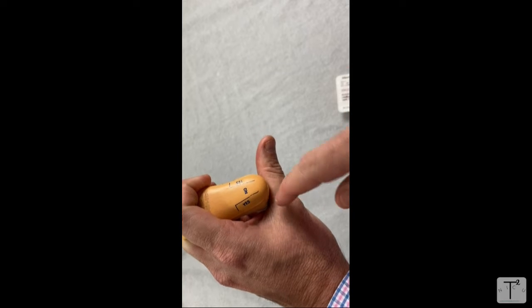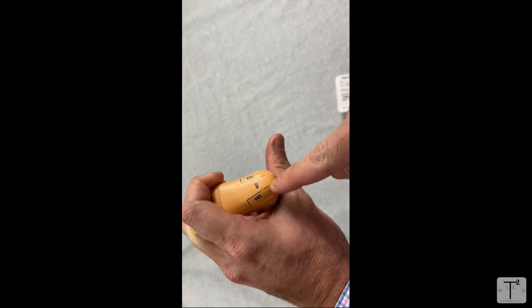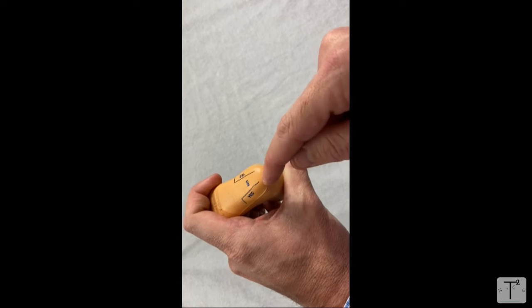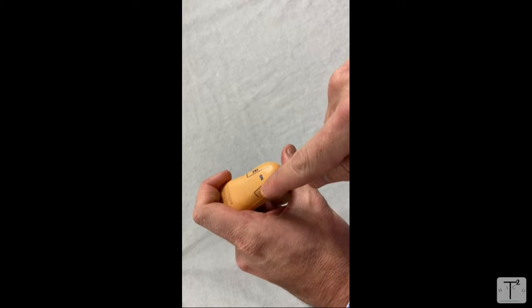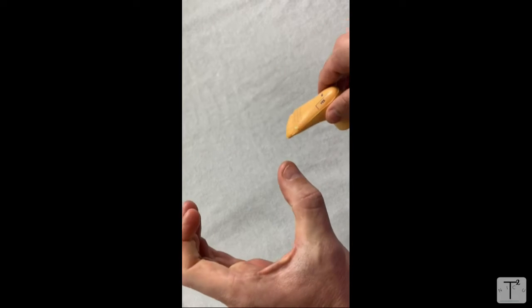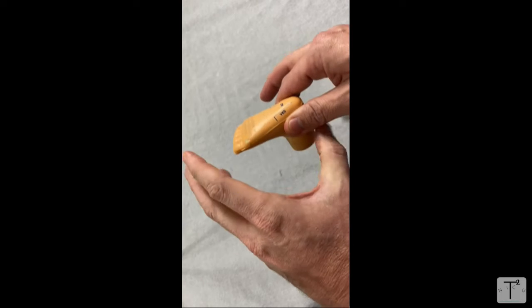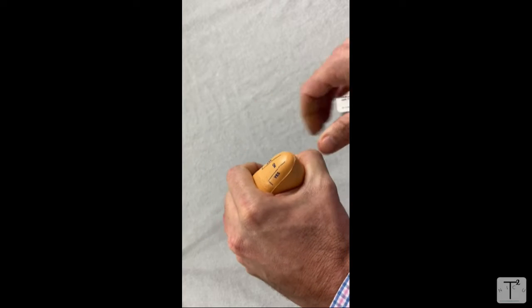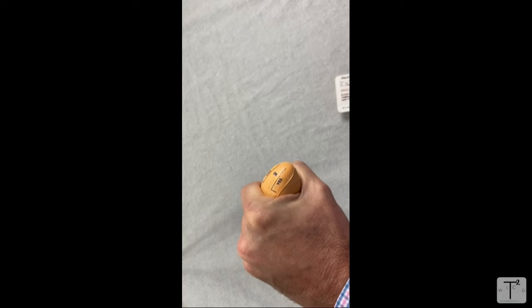If you were to stick down here on the lower part of the heel, what tends to happen is that blood will travel down this direction and you lose that drip. Remember — control the drip. It's best to start up higher. The squeeze part comes when you take your C-grip and bend that heel downward. You're actually squeezing on the calf side. When you go to squeeze, you're doing this. About two squeezes — your blood should drip down this direction and you should be able to capture that drip.